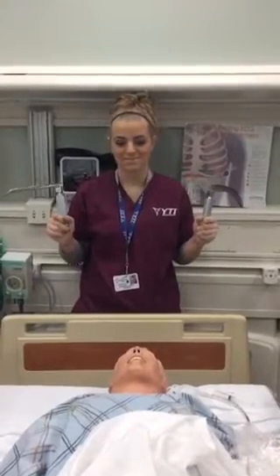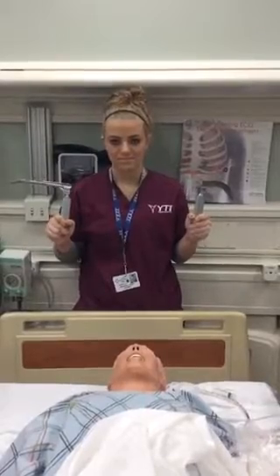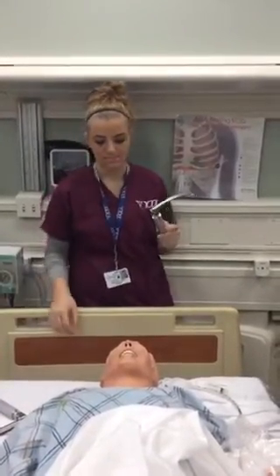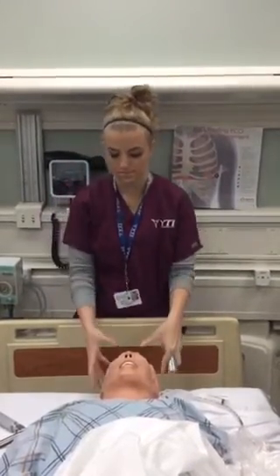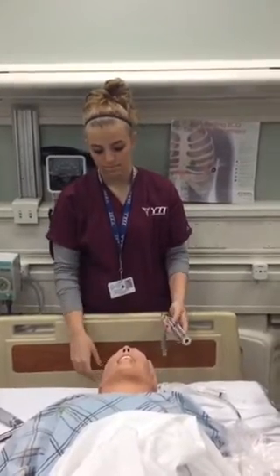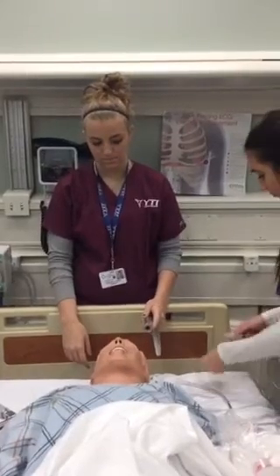Select the laryngoscope with the Miller straight or Macintosh curved blade. Make sure the light bulb is tight because it will not light if loose. If the light source is dim or yellowish in color, the batteries are weak and should be replaced. Place the patient in the sniffing position, which is the head above the shoulder level. Select the proper size of ET tube, insert air into the cuff to make sure it holds air, and then deflate the cuff.